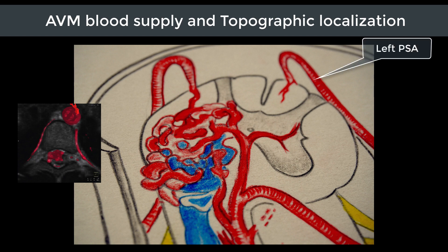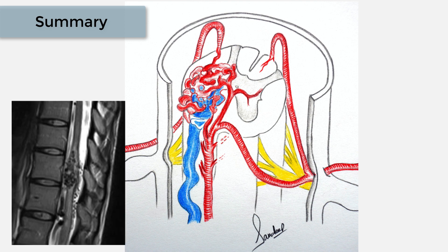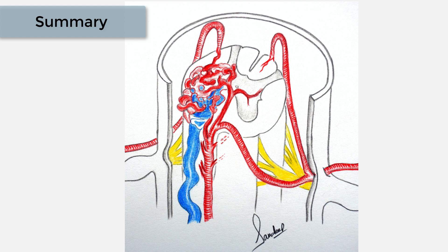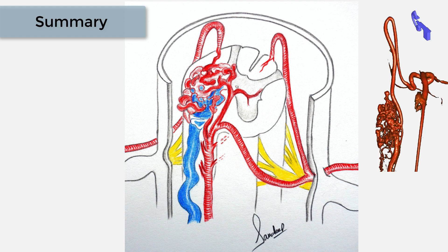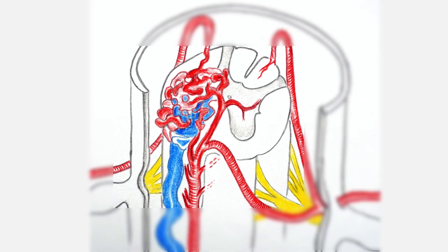In summary, this is a case of spinal cord AVM involving the ventral aspect of the lower thoracic cord at T10 vertebral level, supplied by the anterior spinal artery arising from the artery of Adamkiewicz at T9 vertebral level on the left side, and also supplied by the right posterior spinal artery at the right T9 intercostal level.